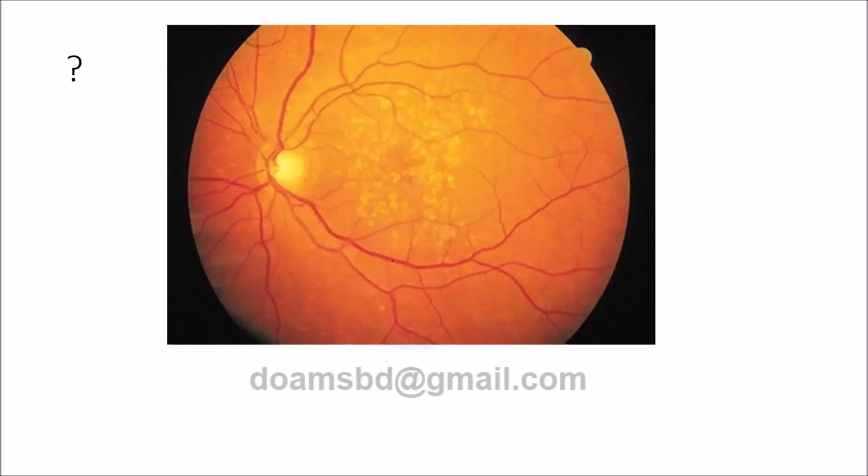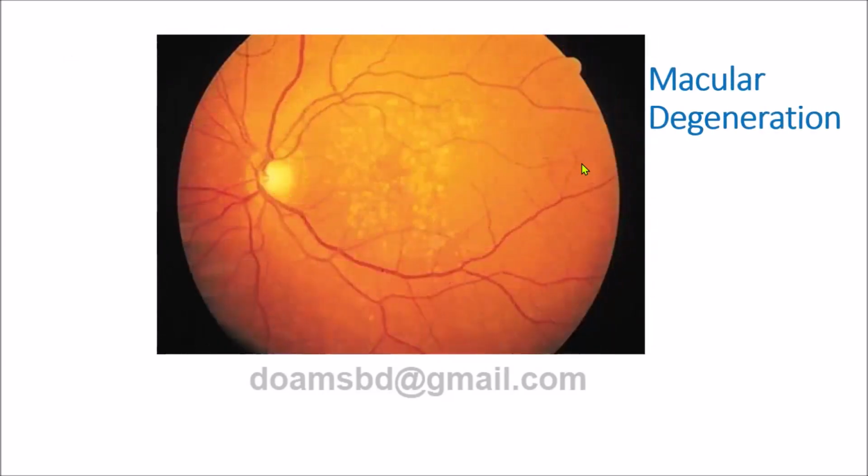So usually it is found like this: multiple plaque-like areas, whitish or yellowish, around the macula. These are called drusen. Drusen can happen without diabetes or hypertension, but it is also found in combination. These are the risk factors, and it usually happens in elderly patients. So this is macular degeneration. Your learning topics will be dry macular degeneration and wet macular degeneration. We will not explain them here because we are talking to beginners today. So this is age-related macular degeneration, because it is a feature of the elderly. It is a very geriatric topic.